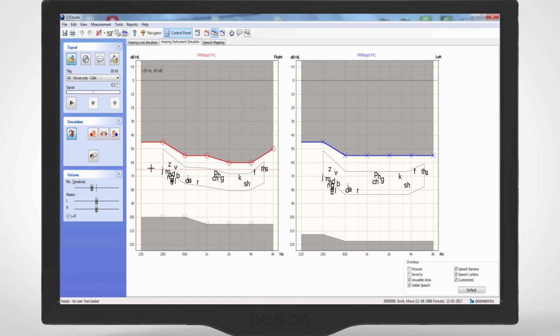You can record either the voice of family members, children, your own voice, or whatever. Or you can speak directly into the microphone. Finally, you can use an external source of stimulation by using Play CD.